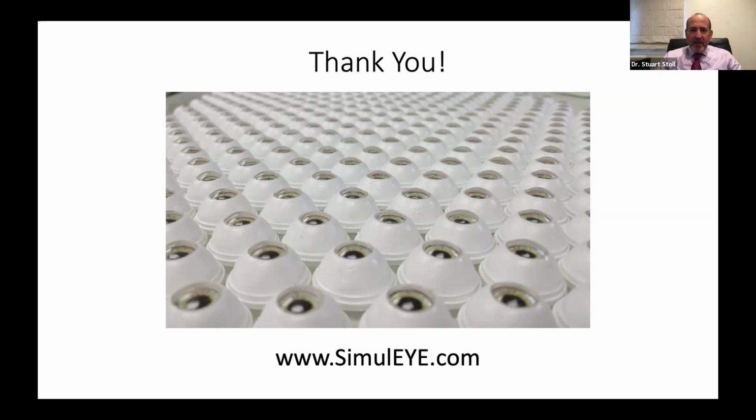For how long can a simulator be used? Well, ours doesn't have much of a shelf life problem. It can sit around for months. The polymer clay might start to dry out after about 3 or 6 months, but that's pretty easily attainable. You can get more, and you can put it on the shelf and revisit it a month later, or after you've had some experience.